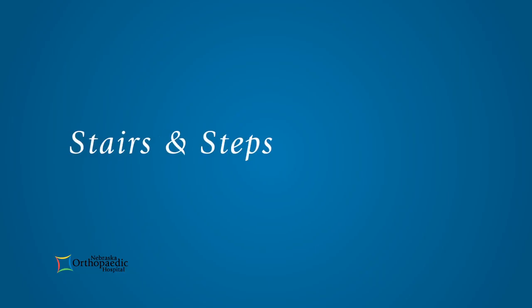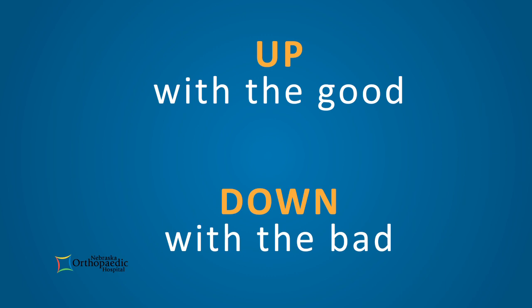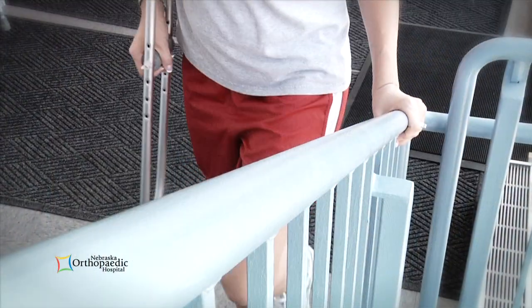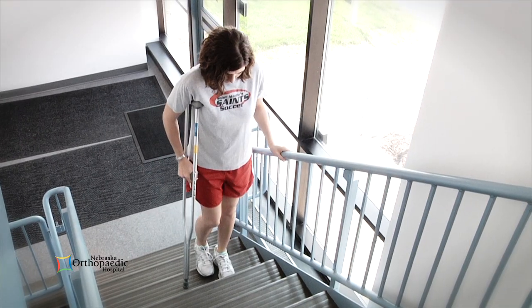When climbing up or down steps, remember this rule: up with the good and down with the bad. This is meant to remind you to go up the stairs with the non-injured leg and down with the injured one. You may use one crutch or both, depending on whether there is a handrail. If there is a handrail, use one crutch on the opposite side of the railing and brace yourself on the railing with the other hand.